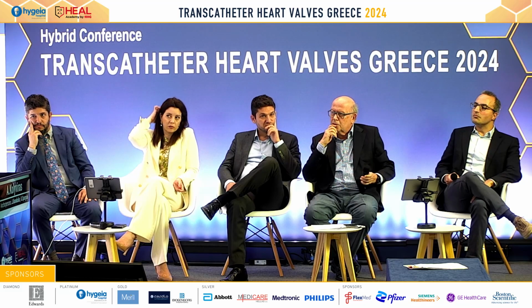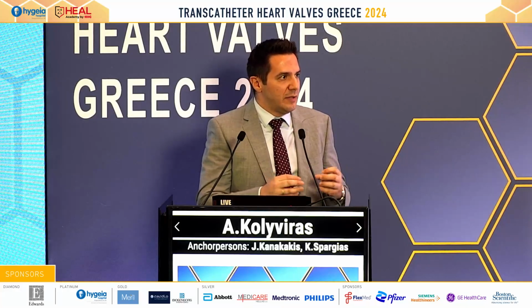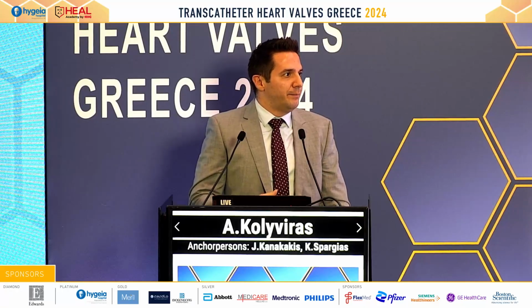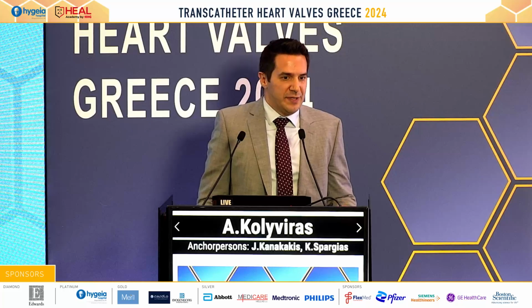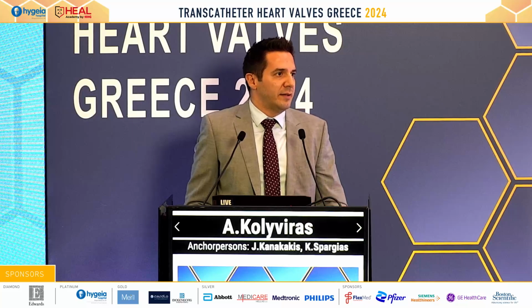Some interventionalists use two ProGlide and one Angio-Seal from the beginning. Do you have any comments about any experience with this? Yes, but as we showed, not as a bailout. I think that using the MultiClose algorithm, we are safe, because if we use two ProGlides and one Angio-Seal, I don't know if we make damage to the vessel, or a vessel dissection, or an occlusion. We don't have to be, how do we say, so aggressive in the arteriotomy, and we check everything at the beginning.